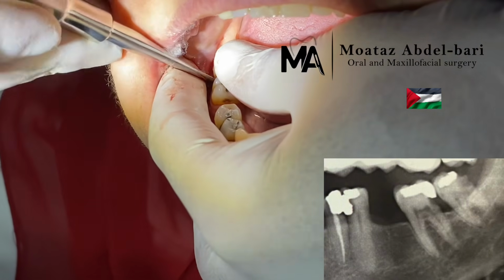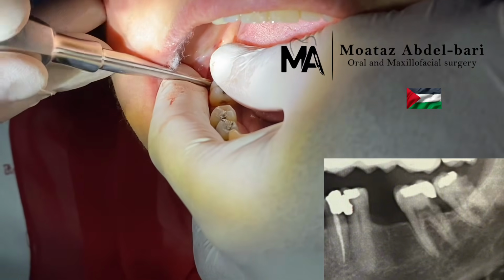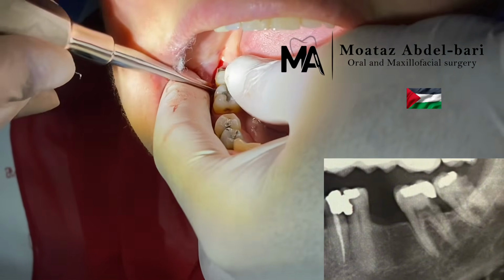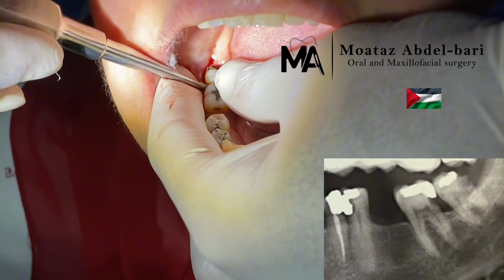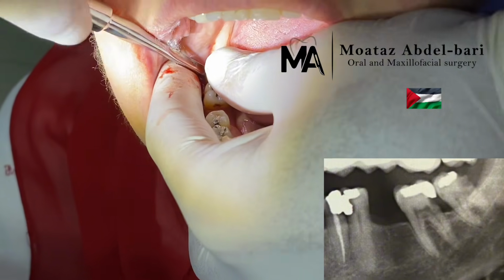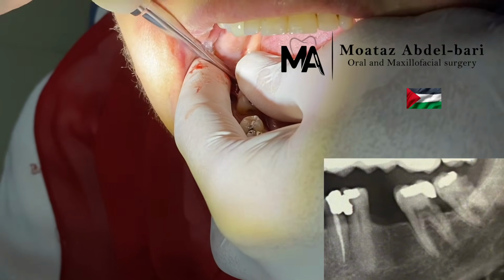trying to gain luxation. You can notice my thumb of non-dominant hand on the occlusal surface of the tooth to assess the luxation range. Searching for any luxation, you have to wait and be delicate, and no need to hurry.